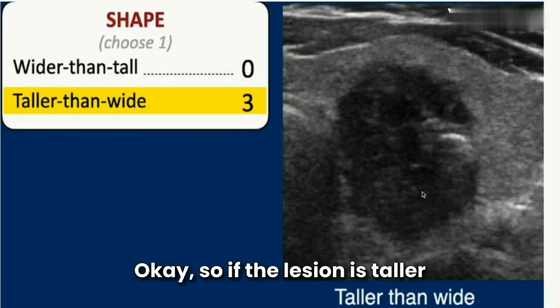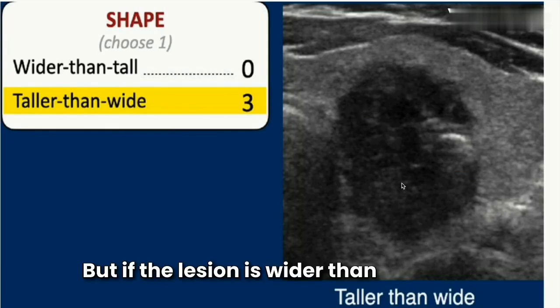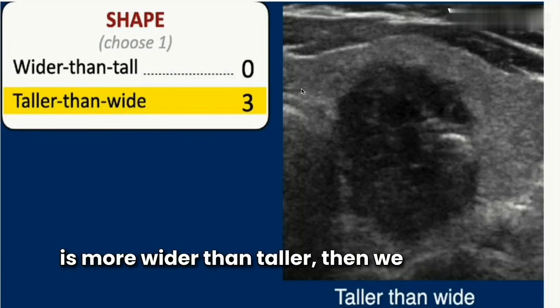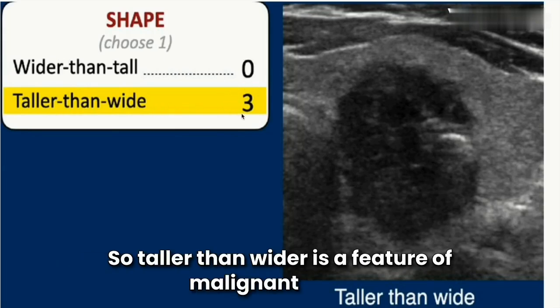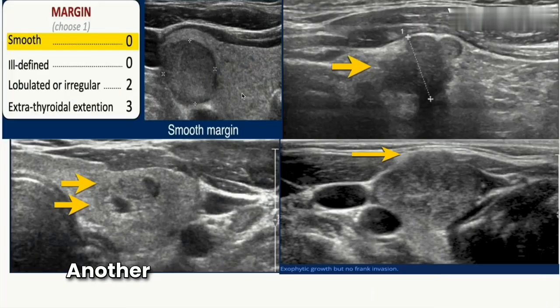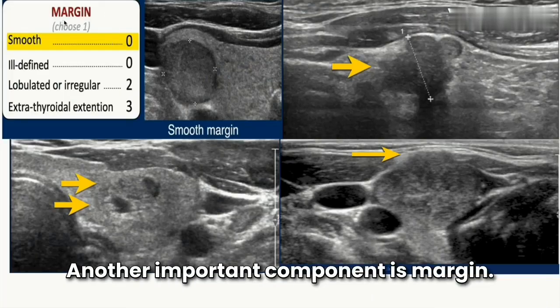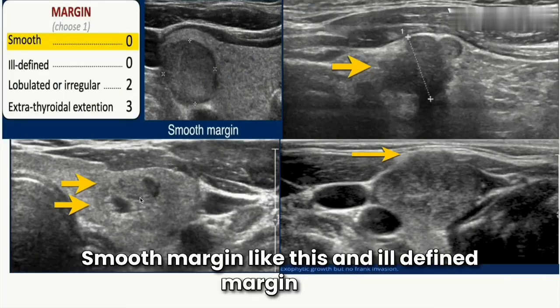The next component is shape. In this image we can see the lesion is taller than wider. If the lesion is taller than wider, we give three points. If the lesion is wider than taller, we give zero points. Taller than wider is a feature of malignancy and scores three points.